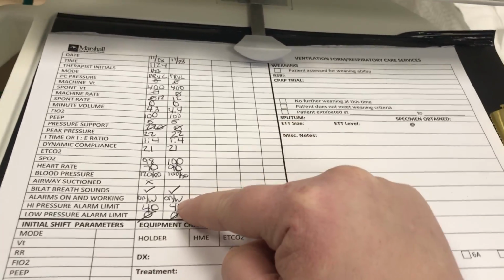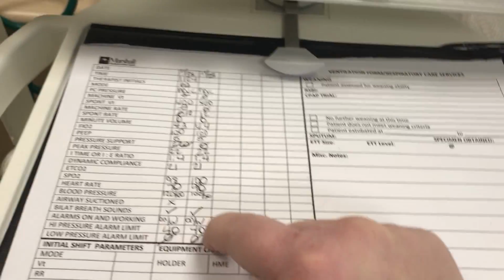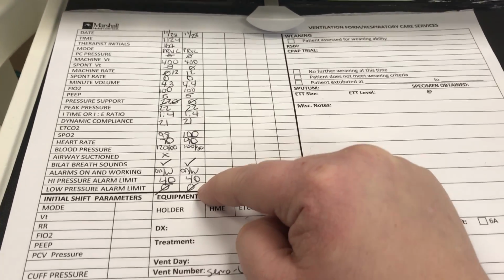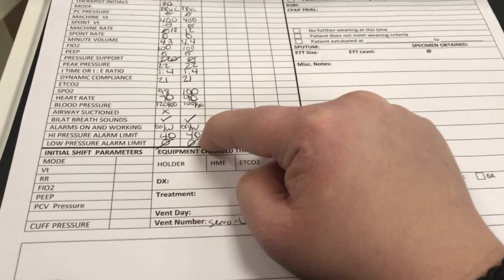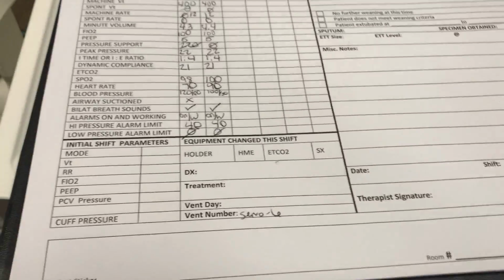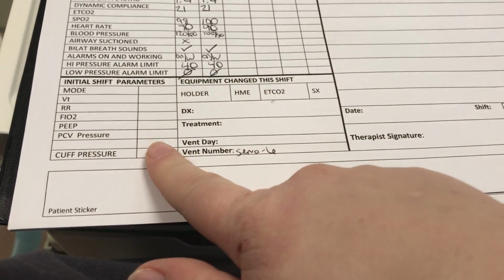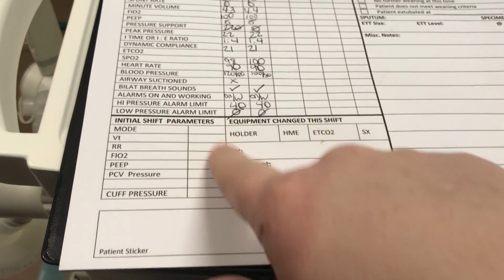I've already looked at my alarms and they are on and working and set at an appropriate level. My high pressure alarm limit is 40, so I write that there, and you can't set a lower one on this one. This one is the initial settings for the shift, so I'd go through and fill that out.